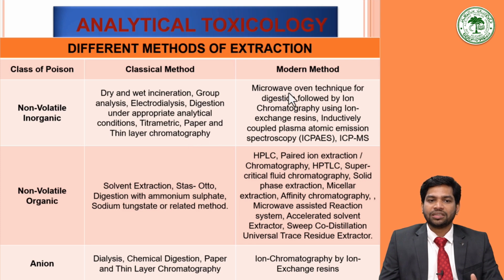Modern techniques include the microwave oven technique for digestion, followed by ion chromatography using ion exchange resins. Then inductively coupled plasma atomic emission spectroscopy, ICPES. Then inductively coupled plasma mass spectrometry.